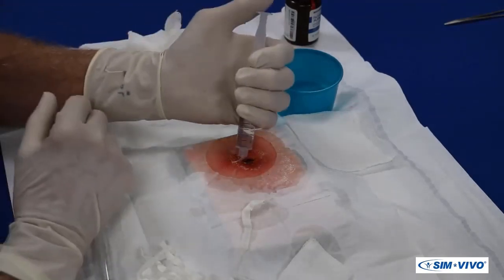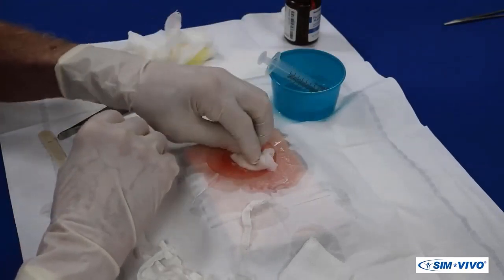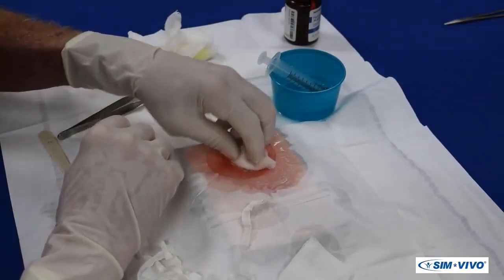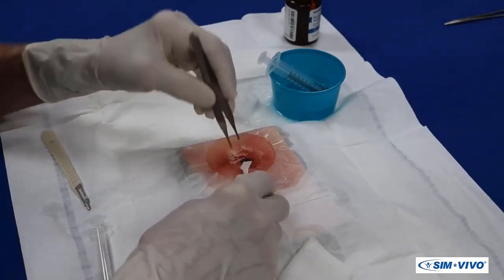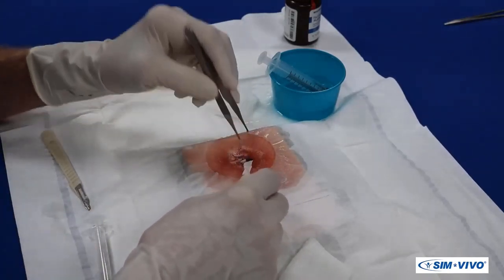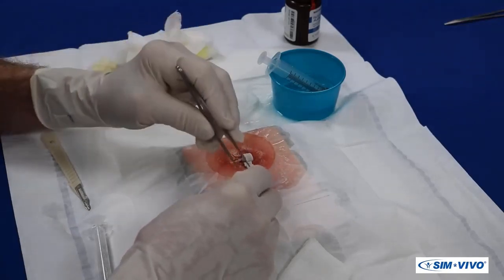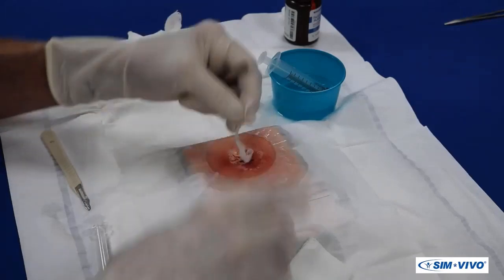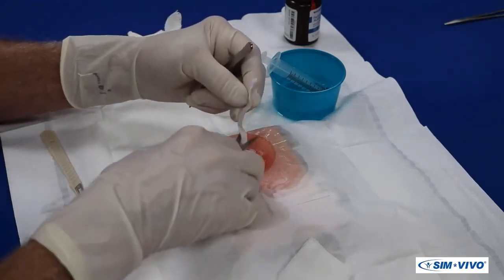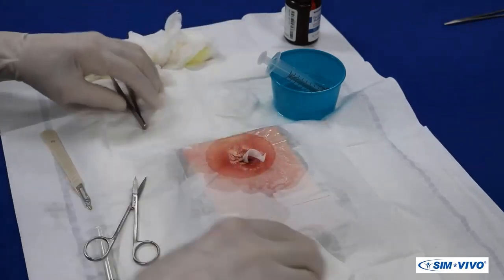Irrigation can be performed if you believe it will be beneficial. Then grasp the end of the new packing strip and place it into the abscess cavity as before. Do not pack the cavity too tightly, as the goal is for the cavity to heal from the inside out. A dressing is then applied.